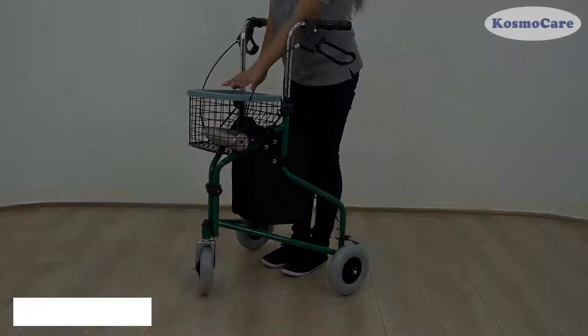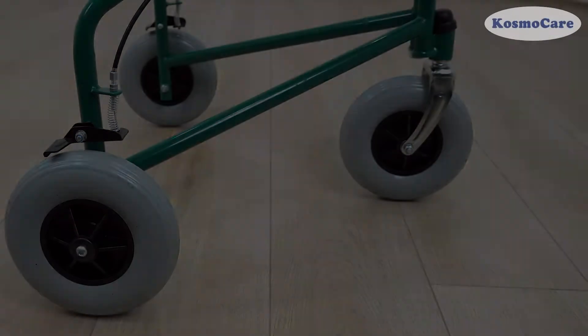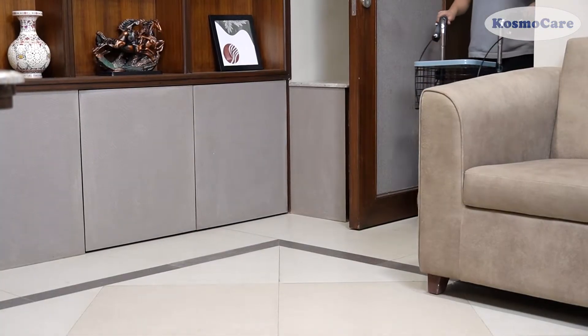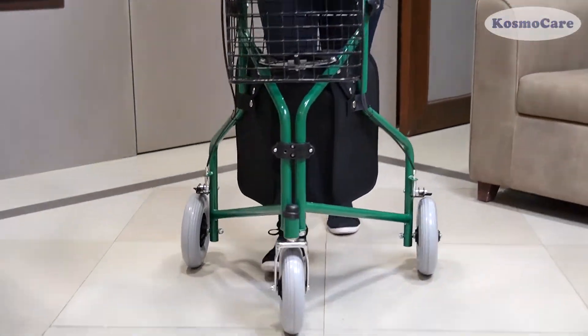The front swivel casters ensure easy maneuverability in and around tight spaces. The unique three-wheel design can fit through narrow doorways and tight spaces, making it ideal for indoor use.